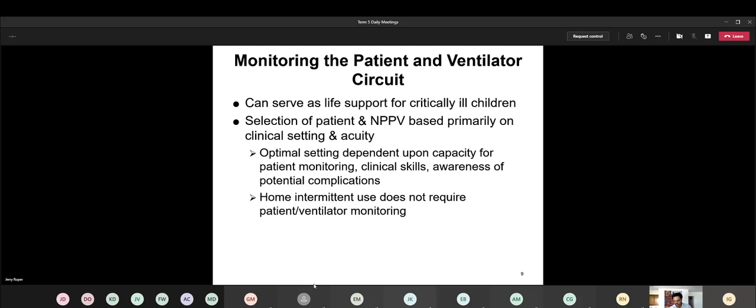All right. And monitoring the patient and of course the machine. So we know that it really will depend on what's going on with your patient, as far as is this even going to work, or maybe this is going to help a lot. And as far as your optimal settings, if the physician isn't giving you the settings, then it means that you're having to do the titrating, or you're maybe having to make the recommendations based on what you're observing.